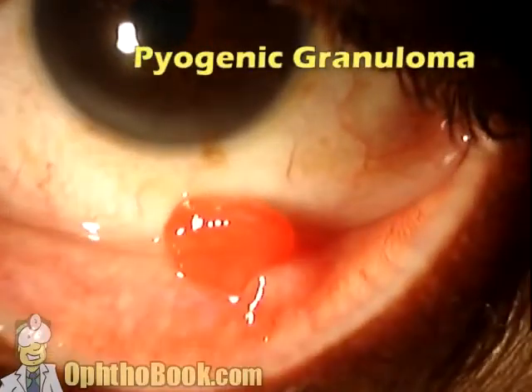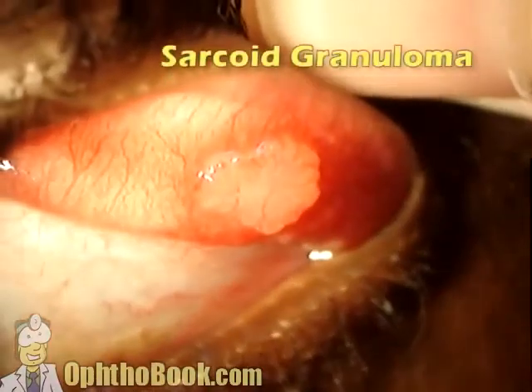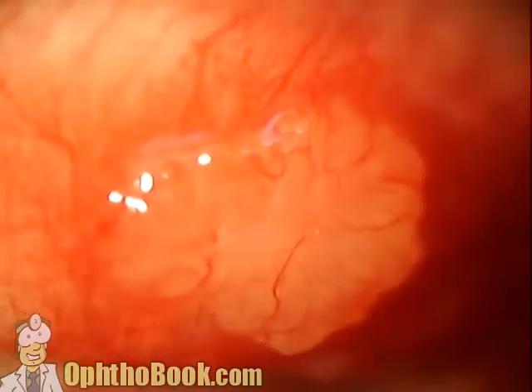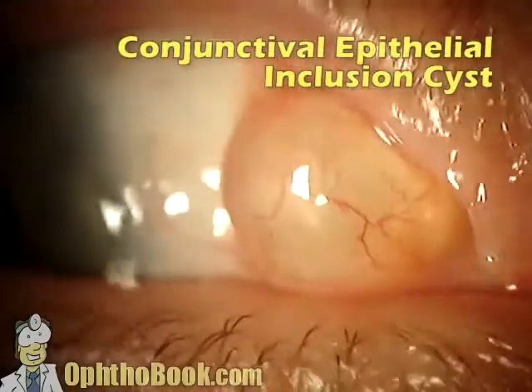Why do I flip the eyelid? Because sometimes you have things like pyogenic granulomas, which is associated with chalazions. We'll look at the upper lid. Here's another lesion. This is some type of granuloma. We biopsy it, end up being sarcoidosis, and we diagnose that disease process. Looking at the conjunctiva and sclera, the conjunctiva here has a very large cystic structure.